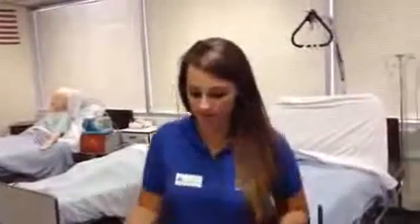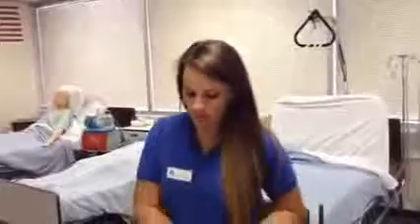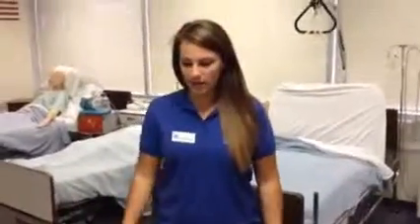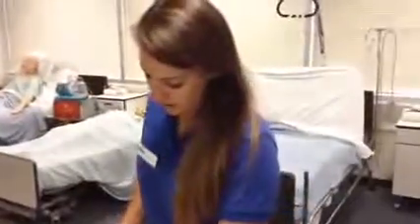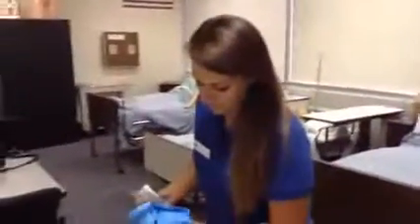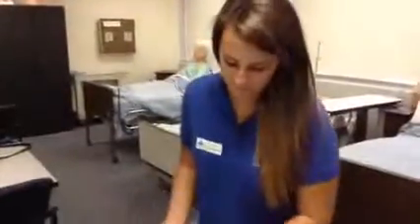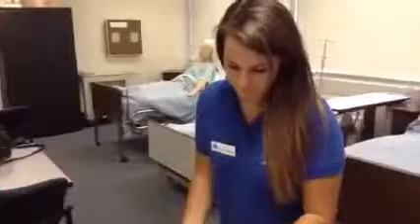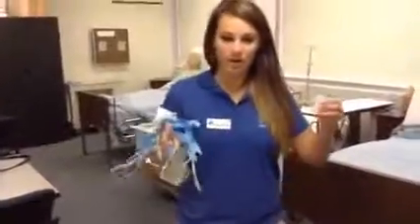Alright, so the first thing we'll be doing is we're going to go ahead and gather all our required equipment. And then we're going to go to the patient's room. Alright, let's go.